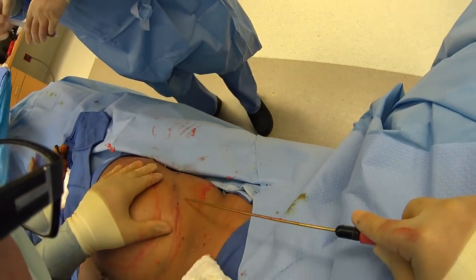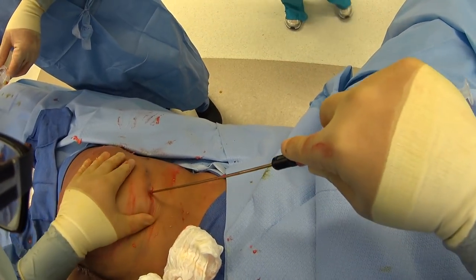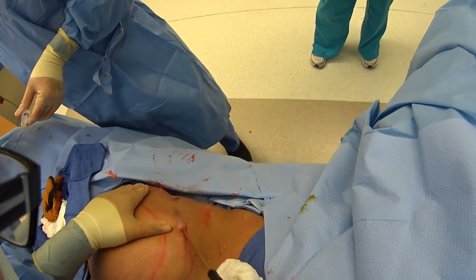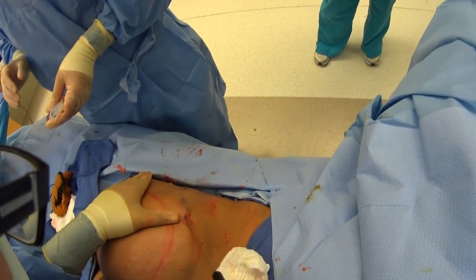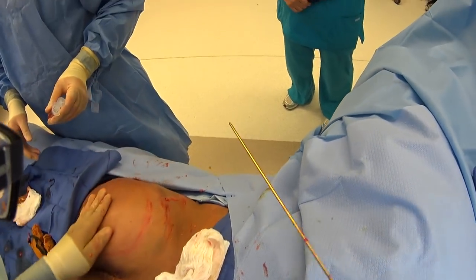This is one of the key parts — you can see this dip here that she had at the beginning. The butt implants made it a lot better, but now we're going to finish filling this with our fat transfer here to really round her out. You can really see where that hip is filling out nicely.